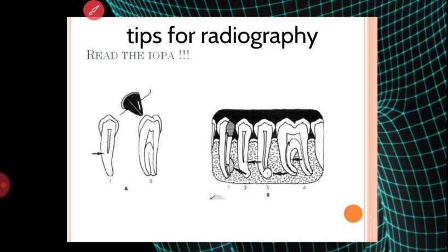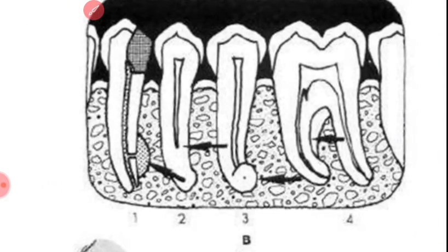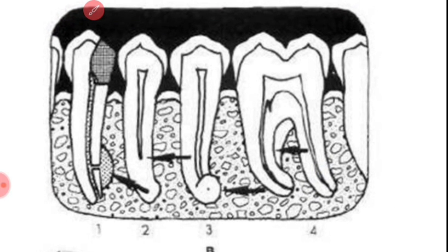The second diagram is of a fast break, a canal dividing into two. The third radiograph shows you when the canal disappears in the last 1 mm. That basically means either the canal is turning buccal or it is turning lingual. So why you need to read this in the x-ray? Because if you find this acute apical curvature, your rotary files, rotating at a speed of 300 or 400 or 250, whatever speed, they can get engaged if there is no path, or they can break, or they can create their own path. Anything can happen because this portion, just imagine the root is really thin.